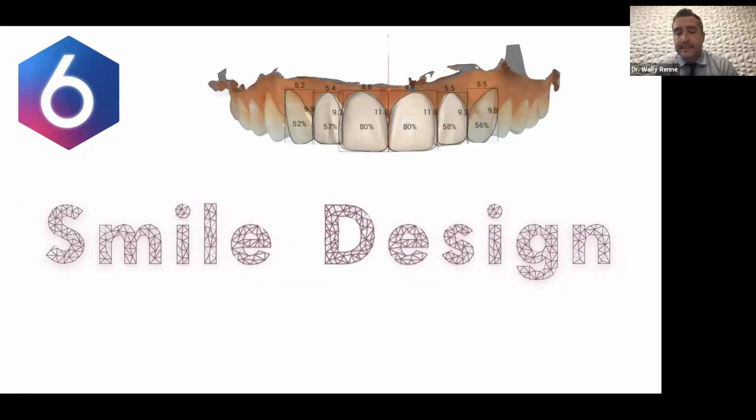Now, today we're going to be focusing on Smile Design. Out of all the suite modules that they have, Smile Design is not quite as well known, and that's why I'm going to try to talk about it today. People are confused on exactly why we do Smile Design. Is it a gimmick just to sell cases to patients, or is it truly useful as a tool for diagnosis? I hope today to explain that it's not a gimmick to sell cases to patients, and it's something that's truly diagnostic.